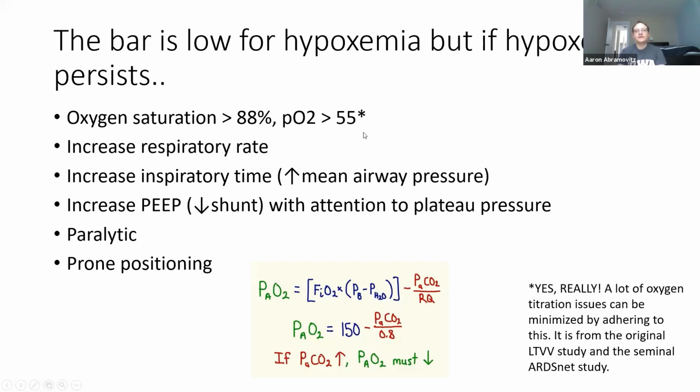And I think that a lot of the oxygenation issues that we have are unfortunately driven by different opinions of goals. Patient with a PO2 of 60, you don't need to go up on the FiO2 if you're strictly following ARDSnet protocol. If different attendings have different goals, as you guys experience every day as part of residency, one day you'll have different goals too. It's nice if you can have agreement and standardization among your group in terms of what your goals are, because that makes things a lot easier for everybody.